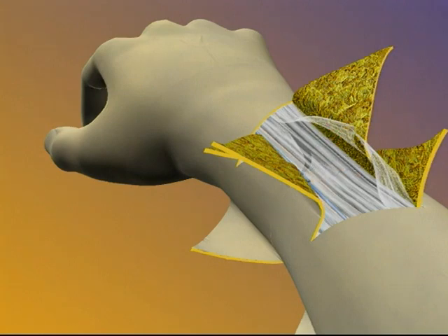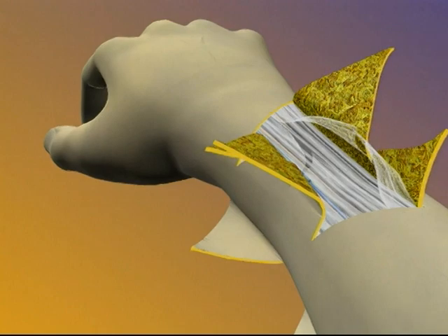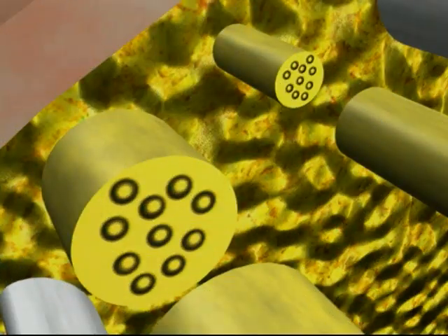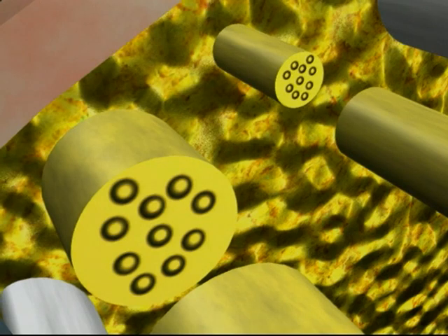After all the tendons have been connected, the surgeons are ready to repair the nerves. A powerful microscope is brought into the surgical field to provide the surgeons with a highly detailed view of the nerves.